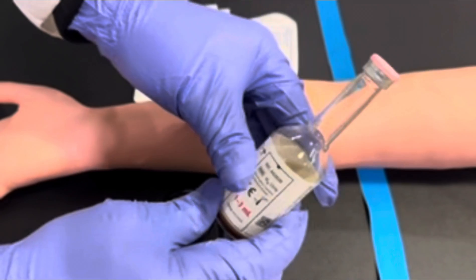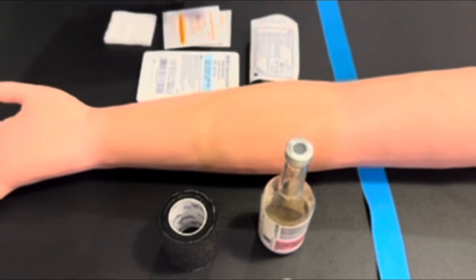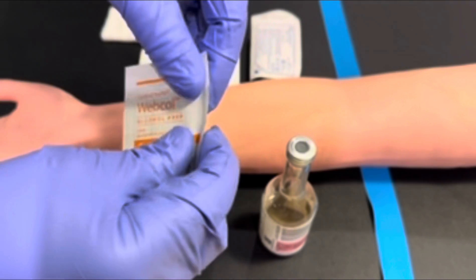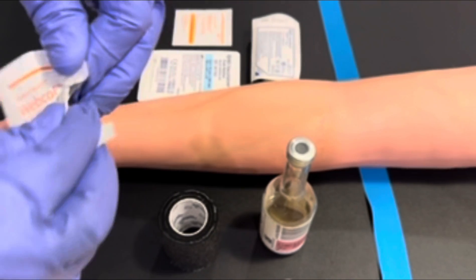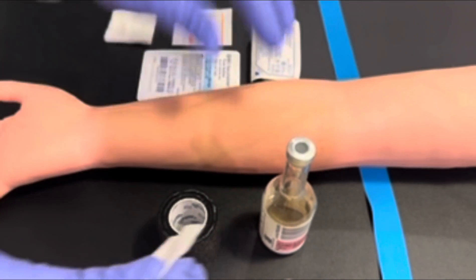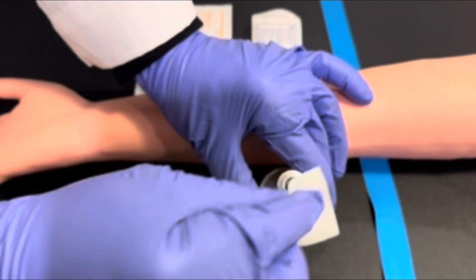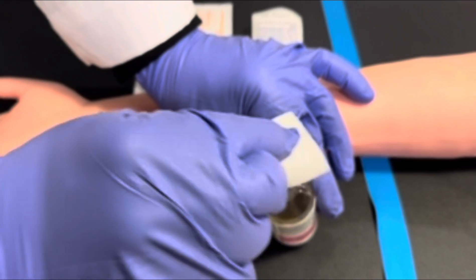With your blood culture bottle, you will take the cap off and clean the top of the blood culture bottle with 70% alcohol for 20 seconds using concentric circles.